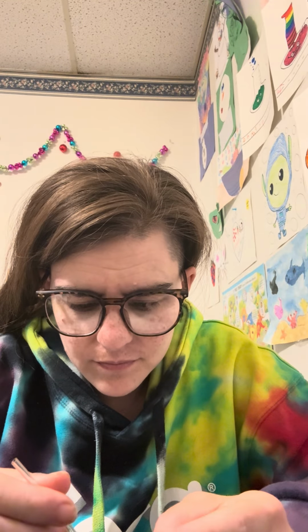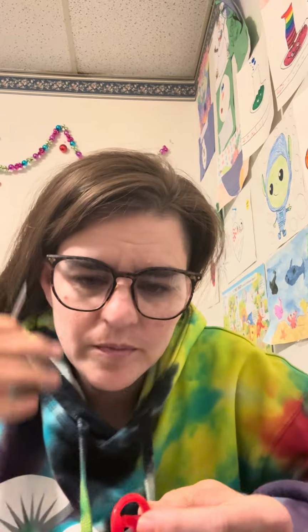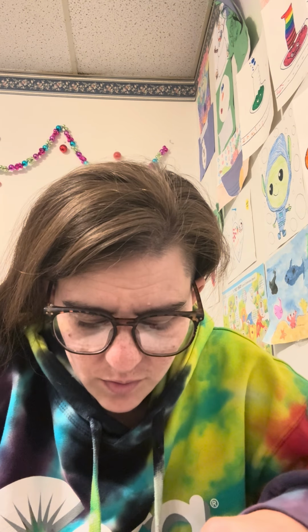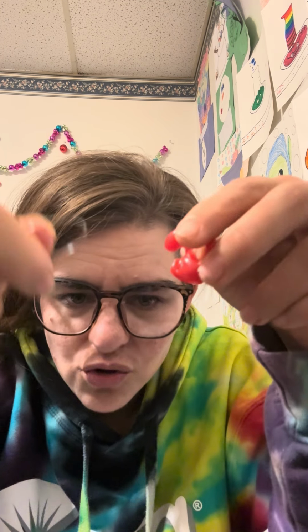Some people don't have a vent. That's for really severe hearing loss in certain frequencies. So there's that. What you're going to do is you're going to take where you put your tubing in through the part. This is the part that goes in your ear, and it'll sit like this.